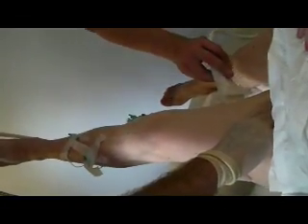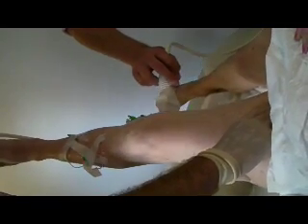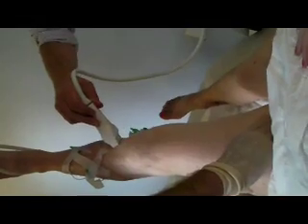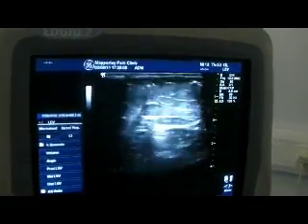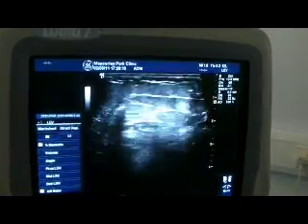Once the treatment has been finished the doctor compresses the junction in the groin and the scientist then scans the leg to ensure the foam is in all the correct places. In this clip you'll see the shadowing on the ultrasound which indicates where the foam is correctly in the veins.